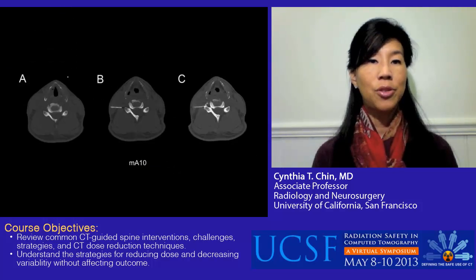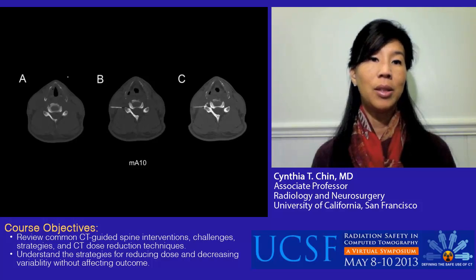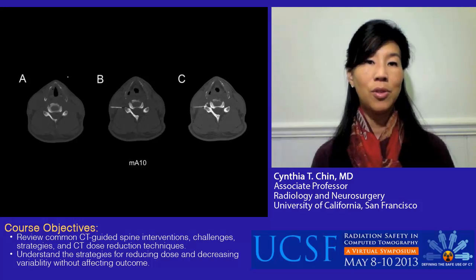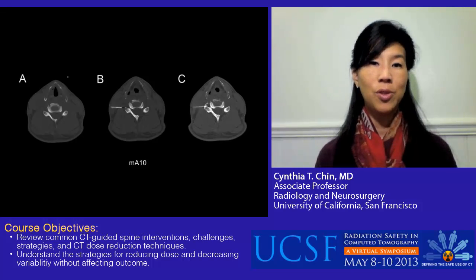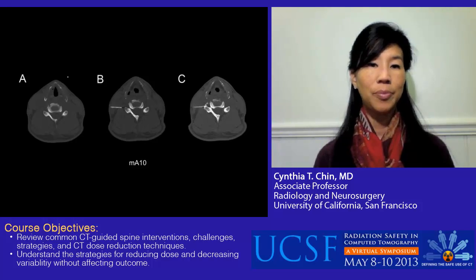The next slide shows 3 images obtained during the guide and contrast phase, and this is at an even lower MA in the same patient. So during the guide phases, with advancement of the needle over multiple passes, we can do this at a lower MA than obtained during the survey view, and you can see that the needle reaches its target, and a jet of contrast shows the precise and accurate placement of the needle in this patient undergoing a C5-6 nerve root block for his trapezius and upper forearm pain.